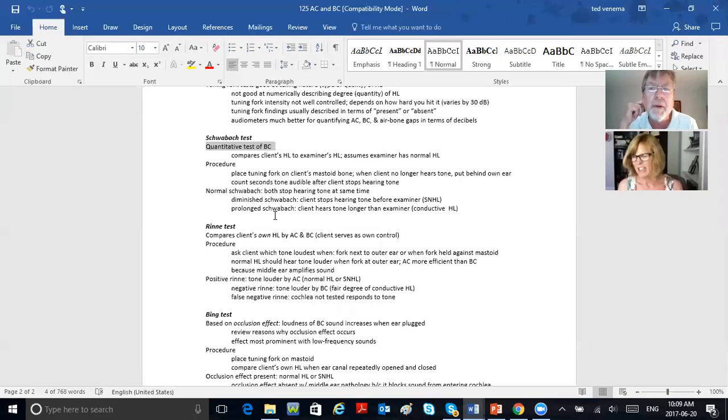I always thought that was kind of a weird test. It counts how many seconds he or she hears it after the client no longer does, and that's to tell the degree of hearing loss. And as we said last week, tuning forks are not good at telling degree of loss.